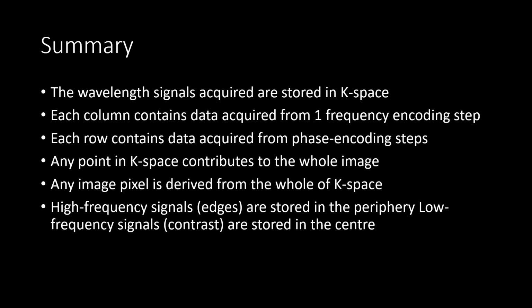By using this property of the K space, we can reduce the scan time. So that is about the K space.